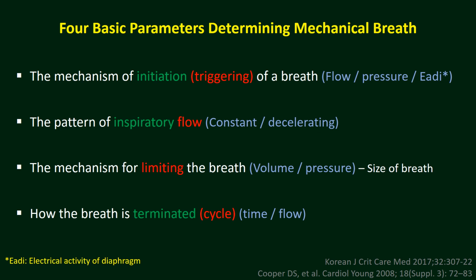These are the four basic parameters determining mechanical breaths. We have a separate lecture on it, but to understand today's topic, I shall briefly discuss this. First is triggering, which is the initiation of a breath, how the breath will be initiated by the mechanical ventilator, whether it will be initiated after a certain period of time as set by respiratory rate or by the patient itself. Patient trigger further can be flow trigger, pressure trigger or electrical activity of diaphragm.